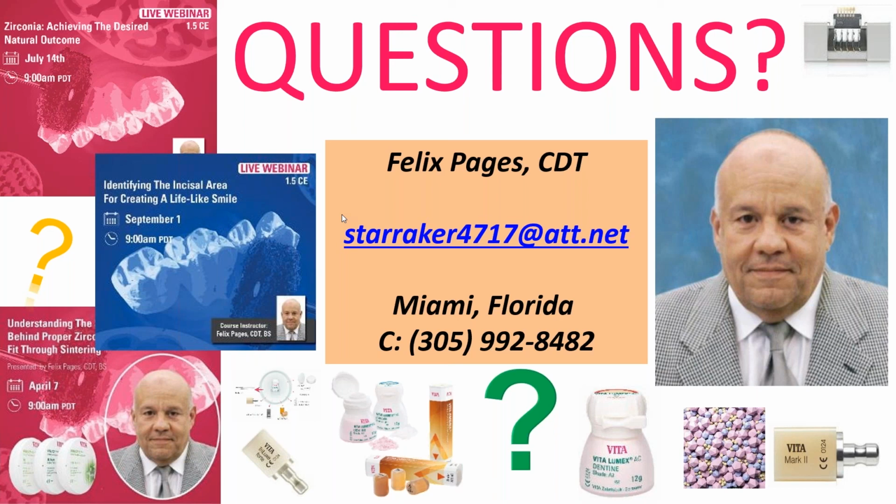I don't ever cut anything dry. I have a sponge, and I push it down, and I grind on it, and dip it back in the sponge. That way I don't breathe the dust, and it keeps it cool. If you try to grind the zirconia after you cook it with a diamond, that's not a good idea, because you're going to fracture it at some point. You're creating some really bad things there. So it's always better to do that.